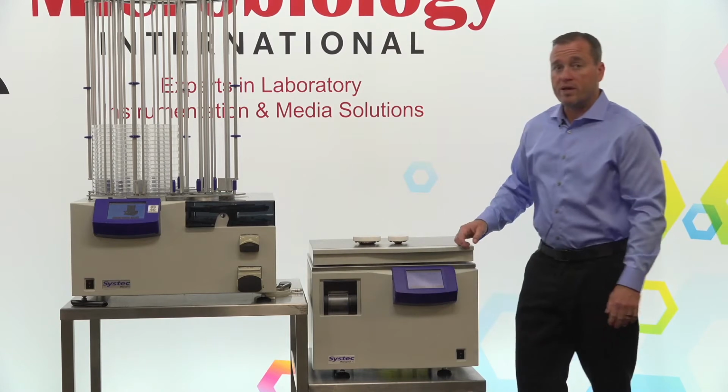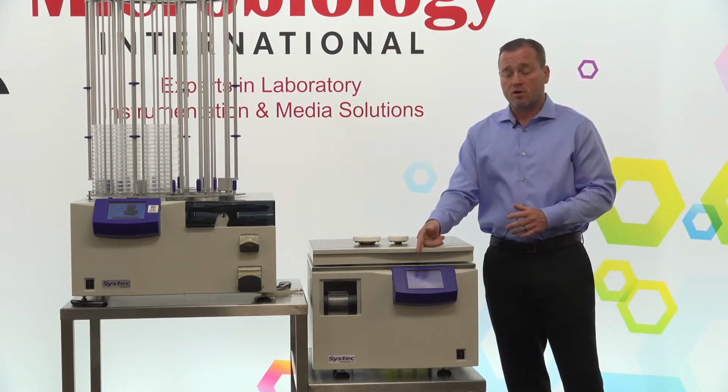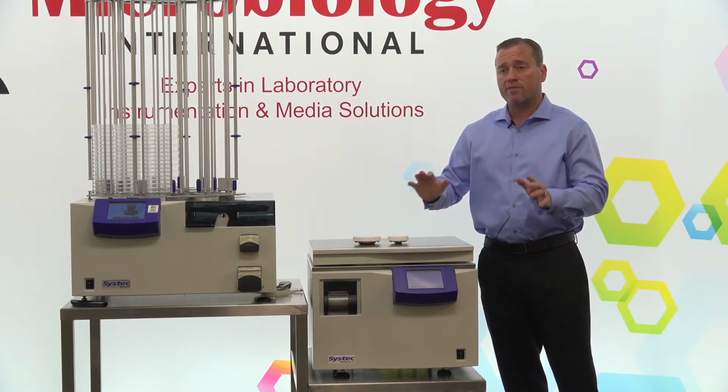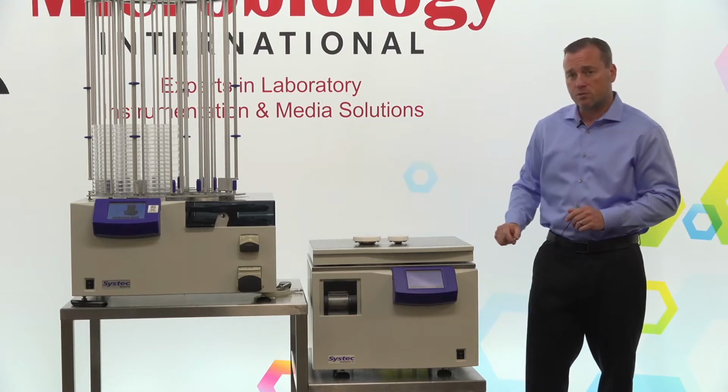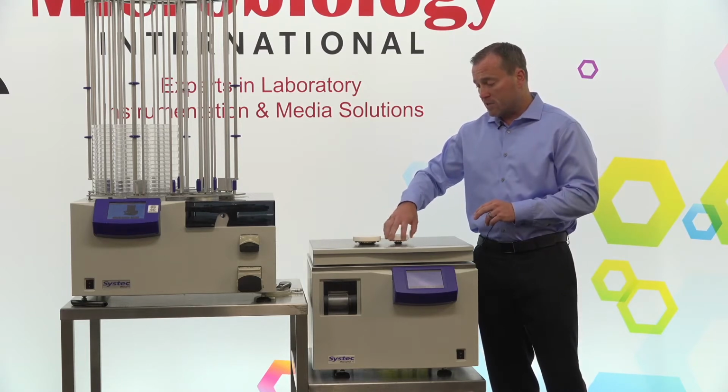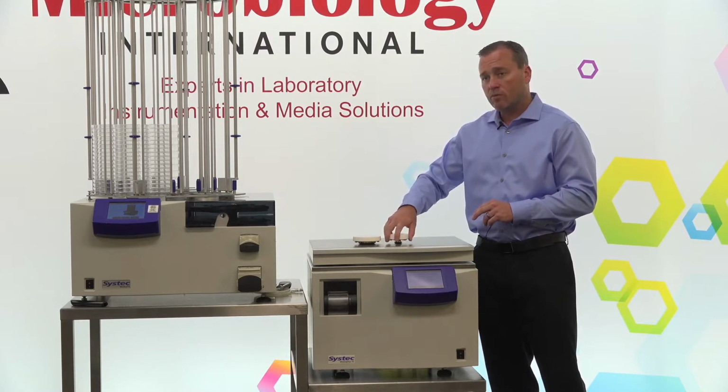Once that's sealed, we can start the cycle just by pressing the start key. We will go through some of the components on the screens once we've given an overview of how the systems would actually operate.